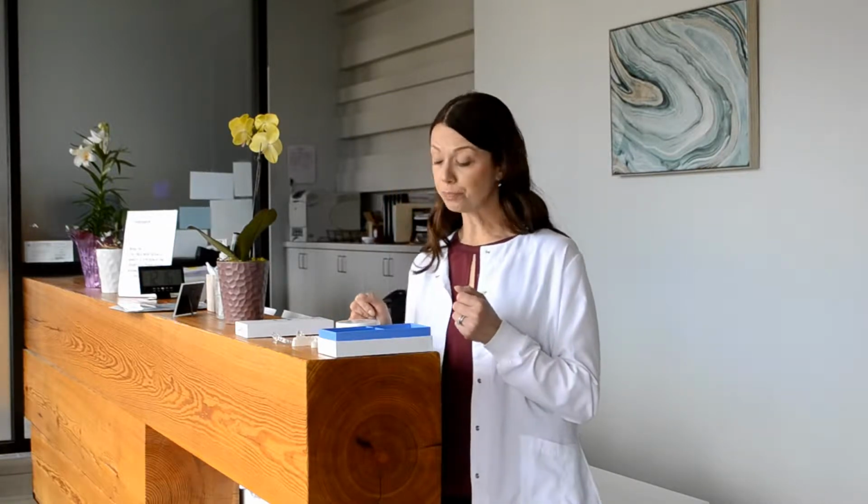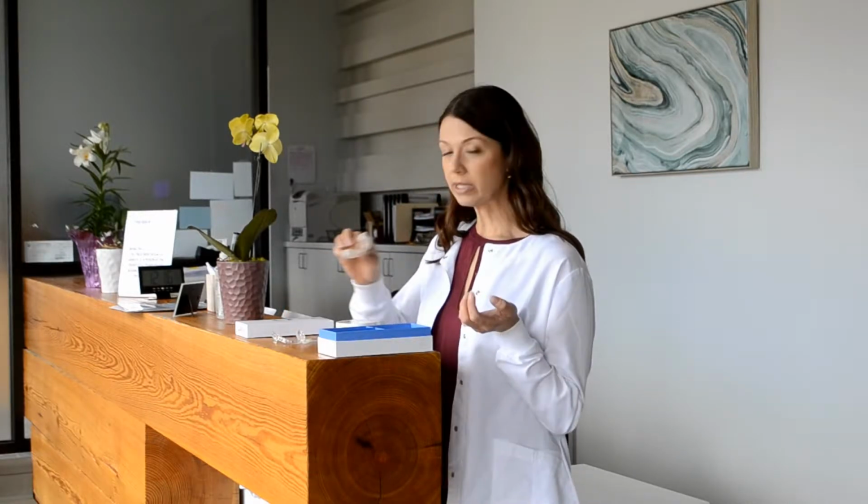It does need to be evaluated by a physician. So we work in conjunction with physicians since I'm a dentist, but we can fabricate these and it's pretty easy to do. I'm going to show you what one looks like just so you know. First, we would take impressions. So the first day you come in, we talk about it, we consult, we look at your sleep study and get the physician's approval for the device, and then we make impressions. We take a top and a bottom impression.